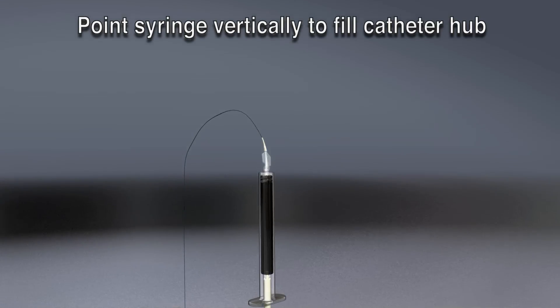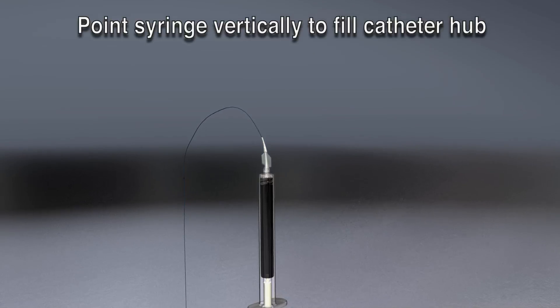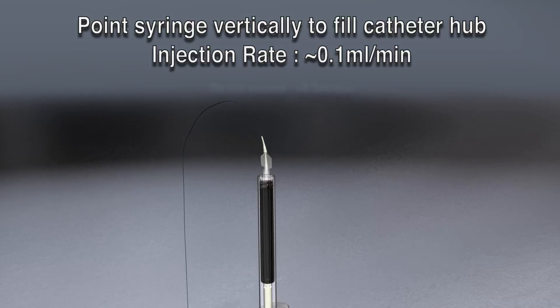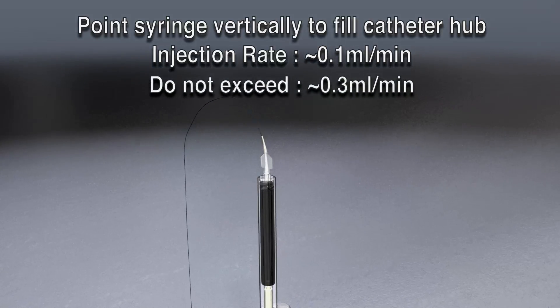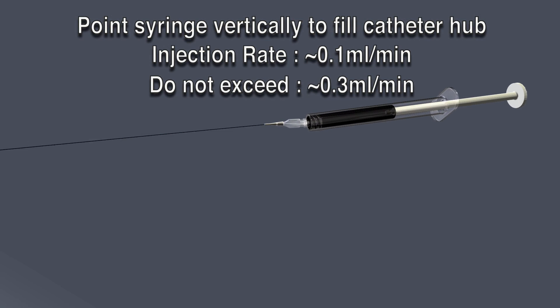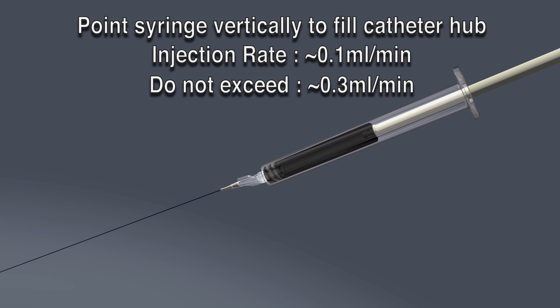Begin injecting the Onyx to displace the DMSO. It is recommended that Onyx be injected at a slow, steady rate of approximately 0.16 milliliters per minute. Do not exceed 0.3 milliliters per minute. Be sure to avoid over-pressurization. Once the Onyx passes through the hub, hold the syringe in a more comfortable position and continue injecting Onyx at the specified rate.